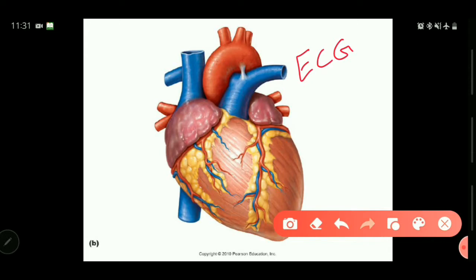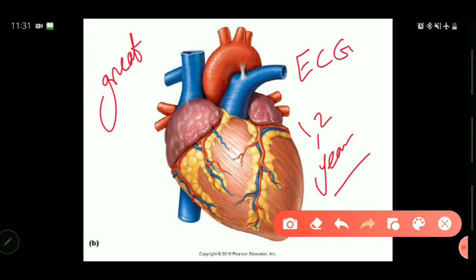But before that, the ECG is so important for all medical students to understand, especially those in the first and second years of medical college, to understand the normal structure of the ECG. Because when you get to the higher levels in the fifth and sixth years, you won't face any problems understanding the abnormalities of the ECG, because you studied the normal structure in the first and second years. So what is the ECG?